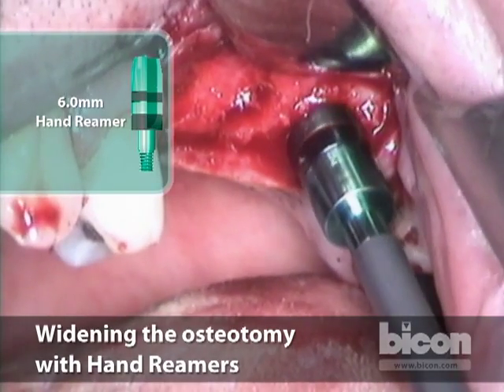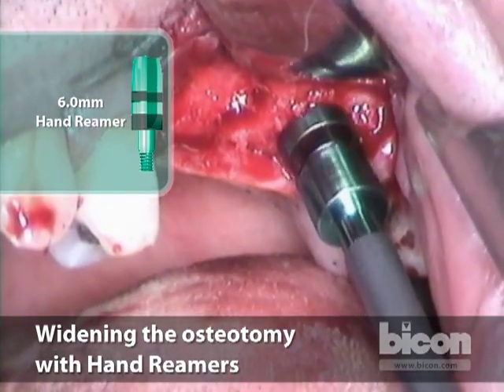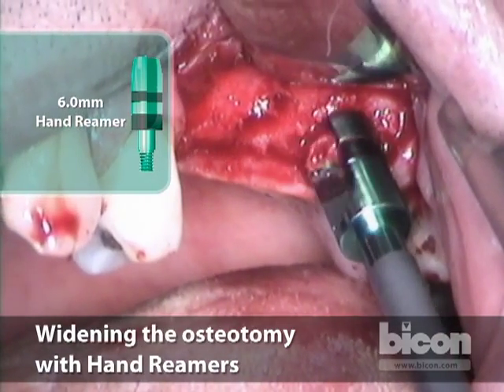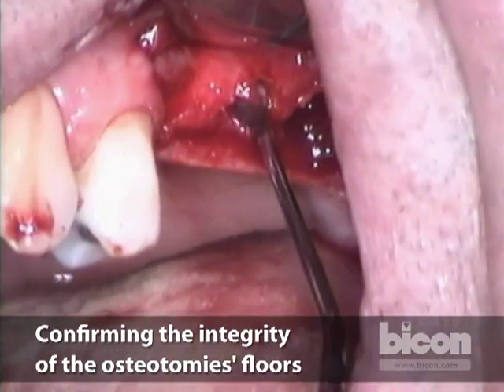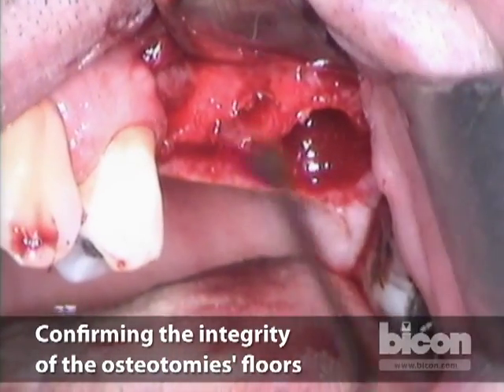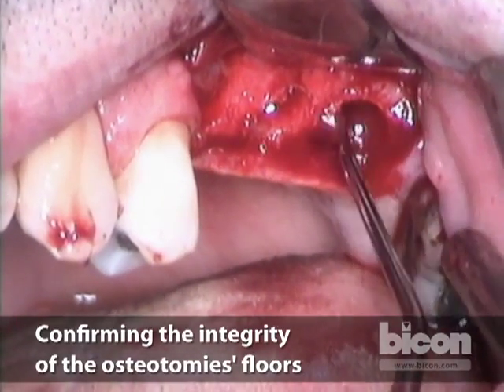This is the sixth and final reamer size. Now we will perform the sinus lift in the first and second molars. You want to make sure you still have a floor — and I do. In the second molar, we also have a bony floor.